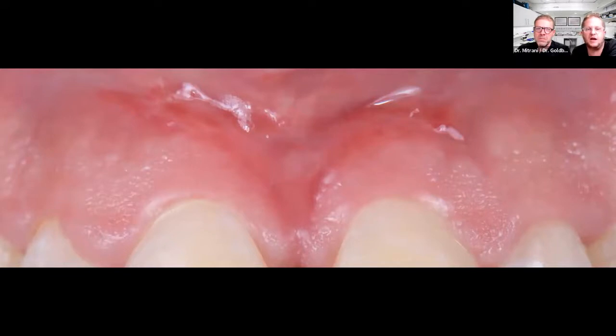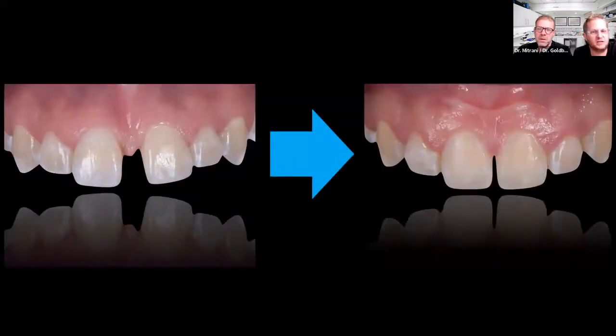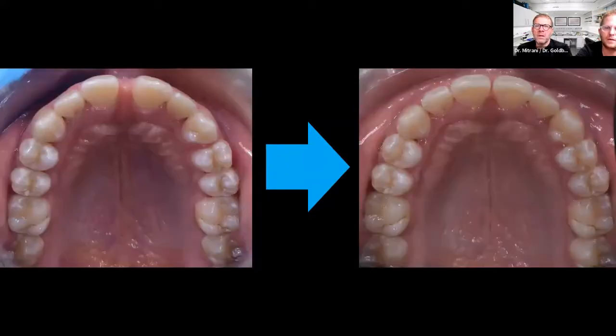And then you can see 3 weeks after the procedure, there's almost no sign of the surgery, and we have a nice result. You can see the new attachment of the fibers is higher up, and that's what we wanted. The patient is still in ongoing treatment. We're still finalizing and want to make sure that we close that gap completely, but we're very happy with the result, and the patient had a great experience during the surgery as well. A couple more pictures just to show the progress of the aligner therapy.